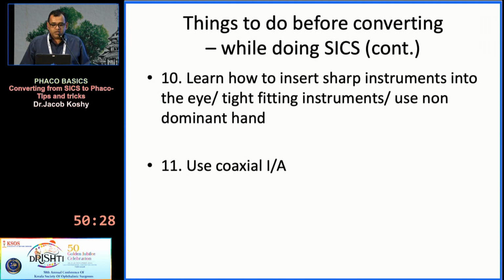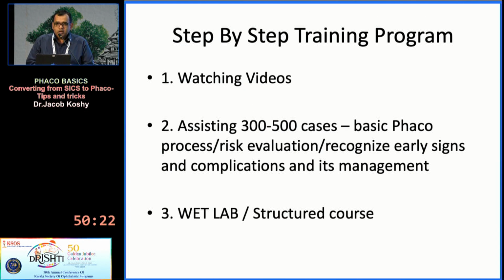After removing the nucleus through SICS, do your IA through the side port and learn how to use the coaxial IA. Now, what we always recommend for all PGs is to do the step-by-step training program, where you don't do the whole surgery in one go. You do it step by step. First thing is to watch videos, watch plenty of videos, assist a lot of cases.